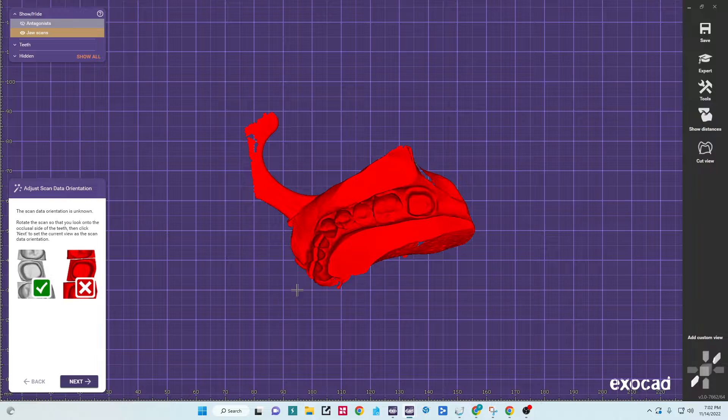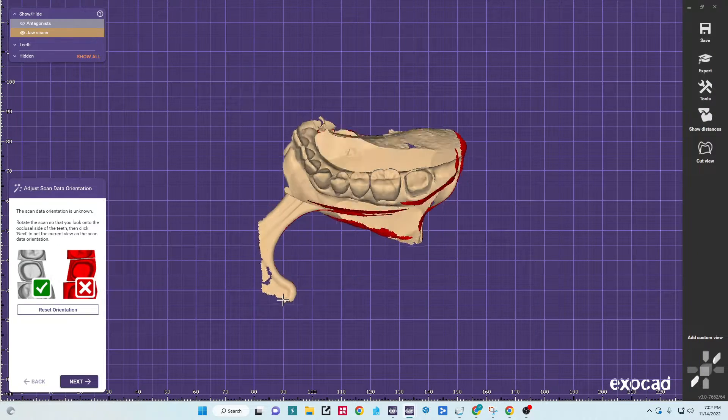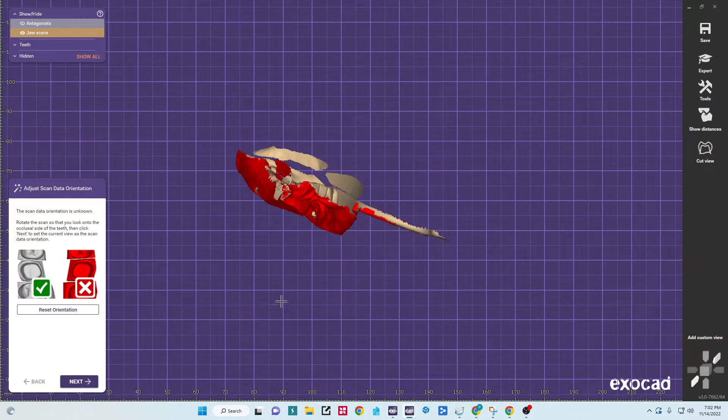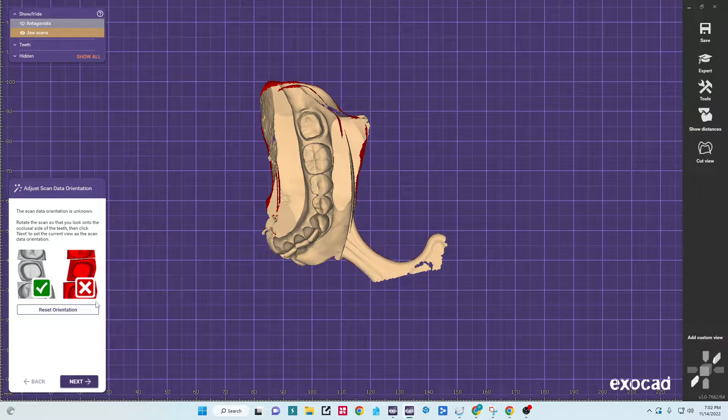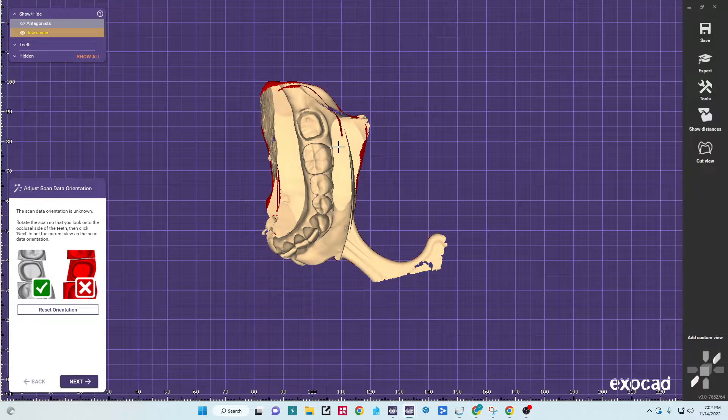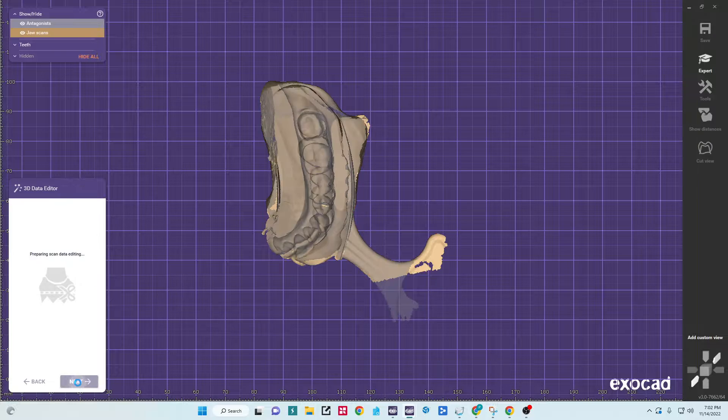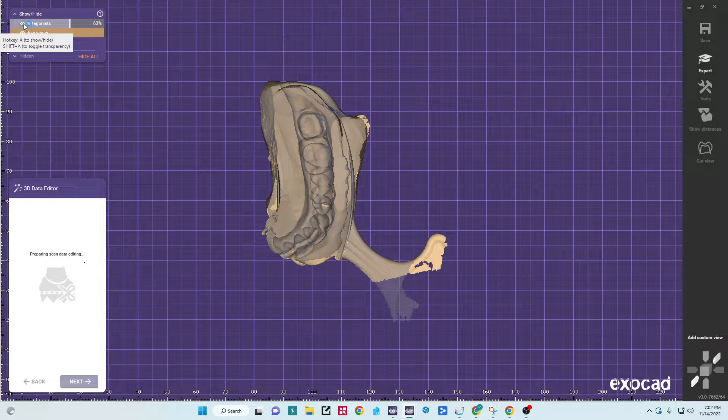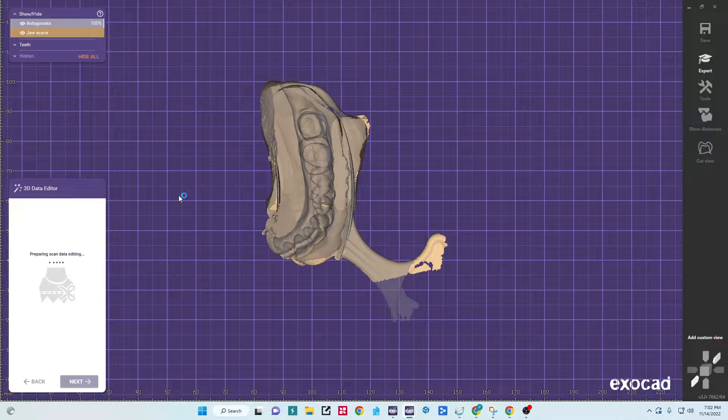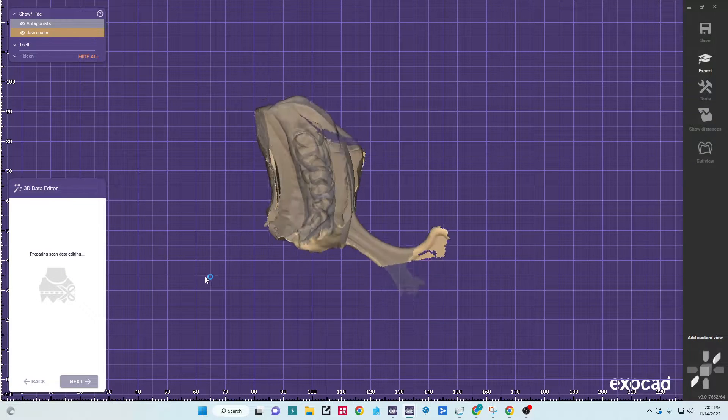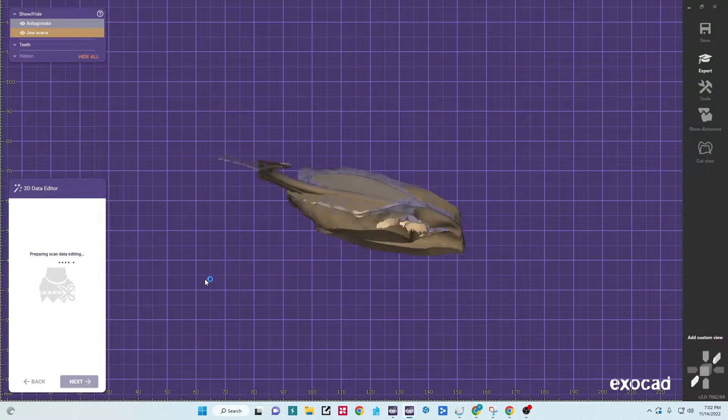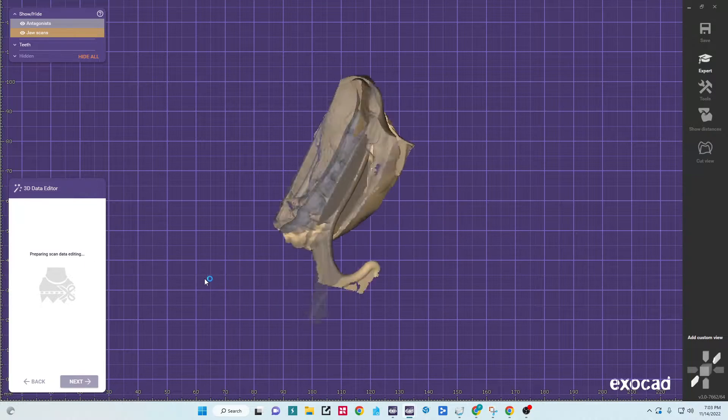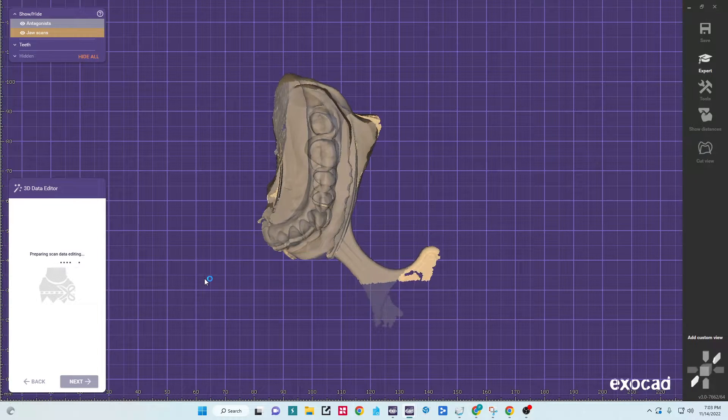So this case we have scanned a triple tray. First thing we need to do is orient the scan data so that it's facing the correct direction. Now with the triple tray scan of a physical impression, we've got this extra data blocking our view.